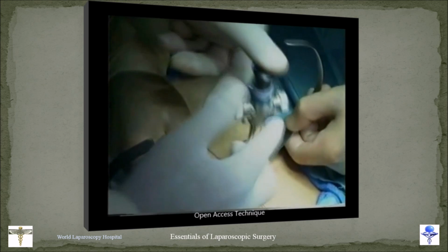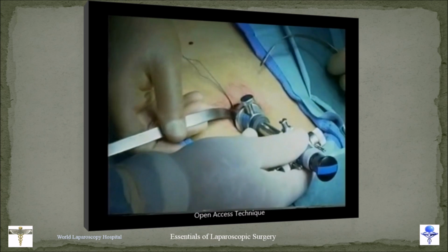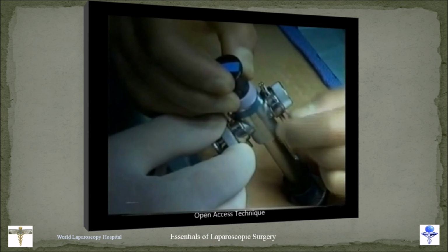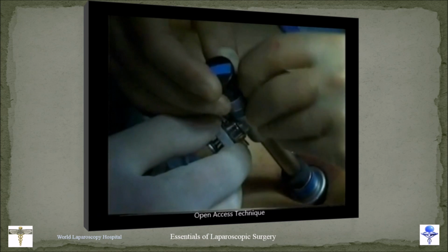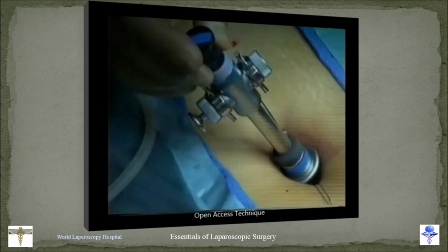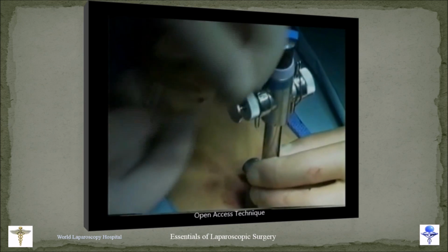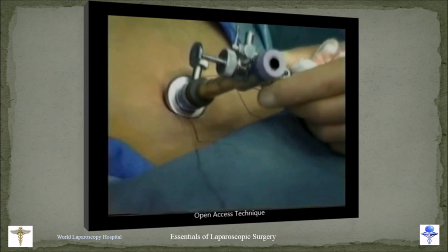Hassan technique has one of the biggest advantages, that any time in your life you will never ever damage the aorta or vena cava, because how can you damage the aorta if you have not used any Veress needle or any sharp trocar. But as far as bowel injury is concerned, Hassan technique sometimes creates bowel injury. If the bowel was directly adherent to the rectus, then even in the Hassan technique sometimes the bowel gets injured, because you cut the rectus and bluntly perforate the peritoneum, you will enter into the bowel.